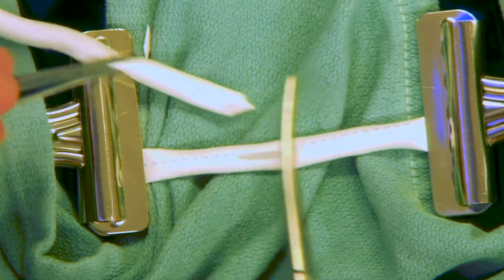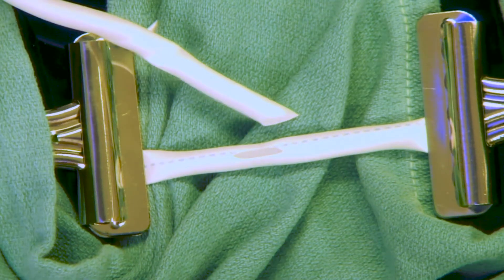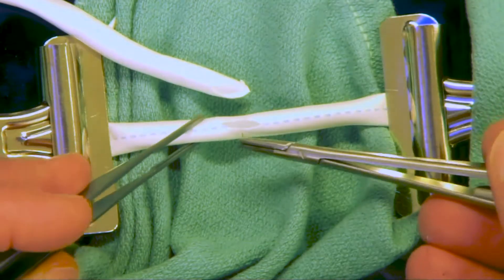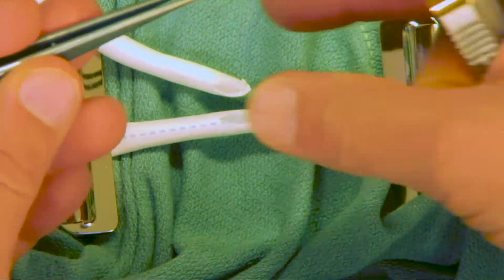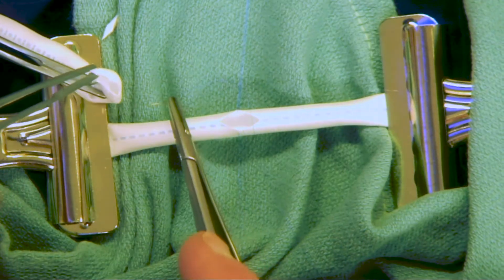Initially, we'll start most end-to-side anastomosis with stay sutures on the piece of the vessel where the graft is going to be sewn down onto. This is done with a small, simple suture on each side, and using mosquitoes or hemostats to hold that suture apart so it can hold the blood vessel open.